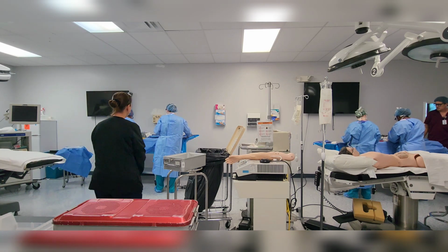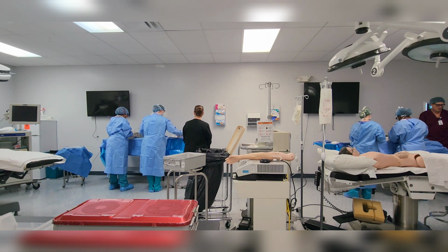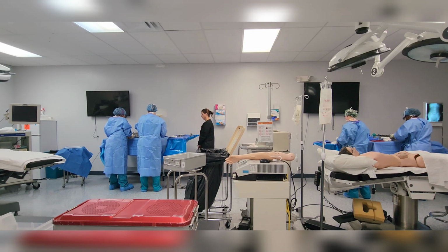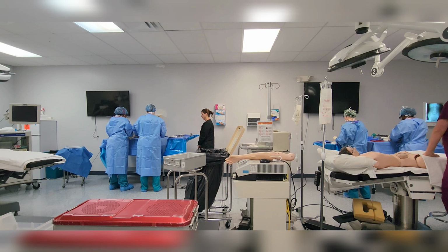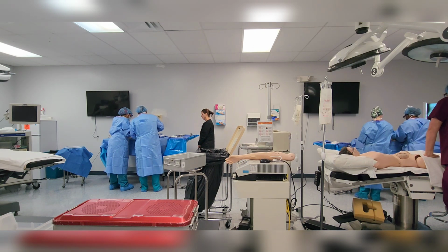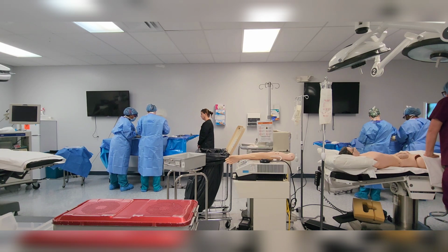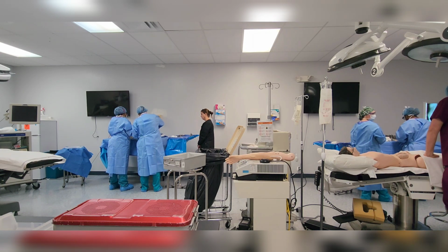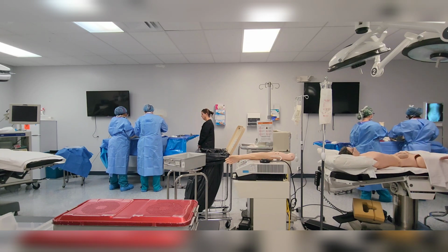I think we need to have a towel roll lesson. Yeah, like this. So get it on there, get organized, and start putting some things on the field. But here's a rule of thumb too. Whatever's on your towel roll, whatever you put on your Mayo, go small. Do you need some more blue towels? That's for the squaring off, right?